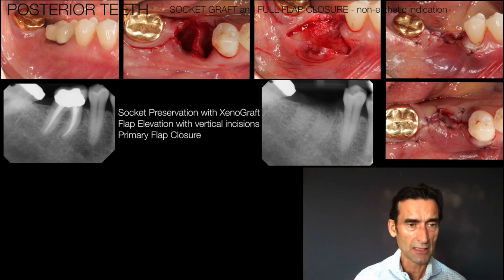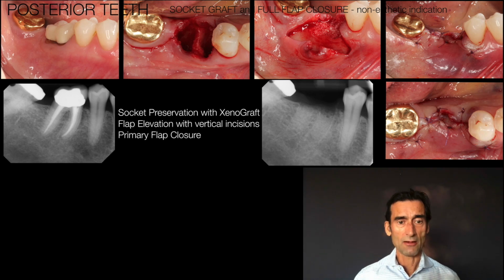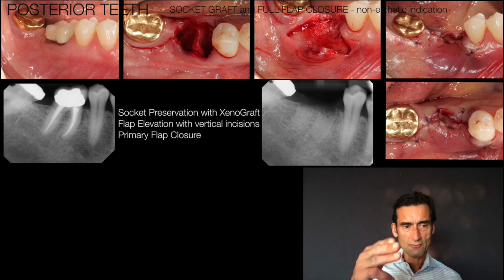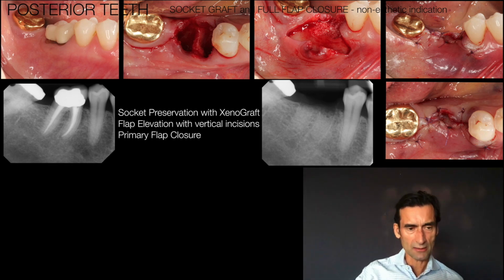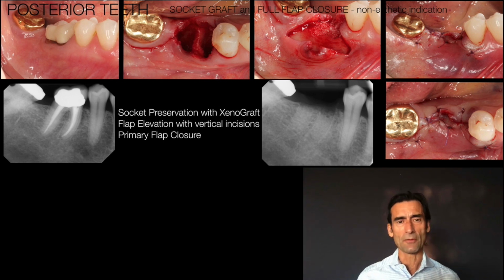So here's a flap management case. If you look at it, on the left photograph, you see the crown and the root canal, and then the fracture that this patient had. So I removed the tooth, the molar. I can always make a hemisection that's really efficient. I can use again the piezo surgery, and you can see that the middle septum is really, really thin, and the mandibular canal also is not too close, but not super far away either.